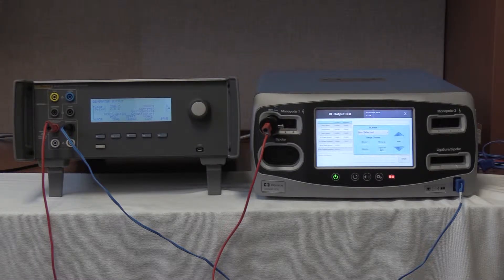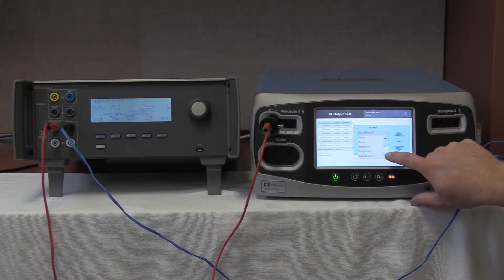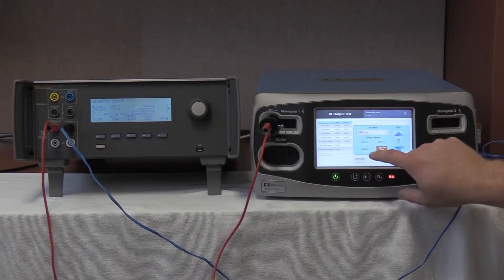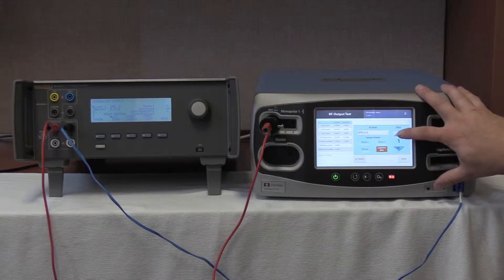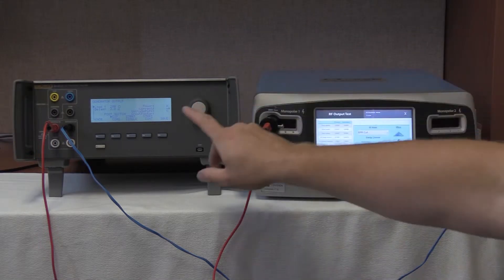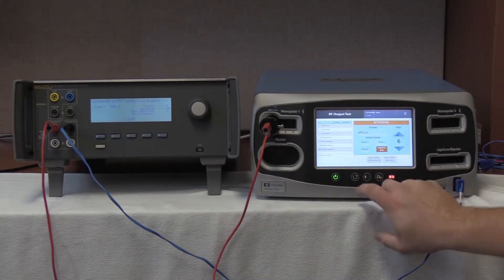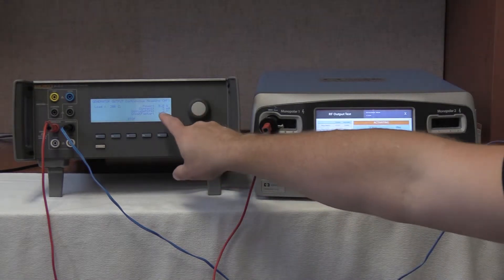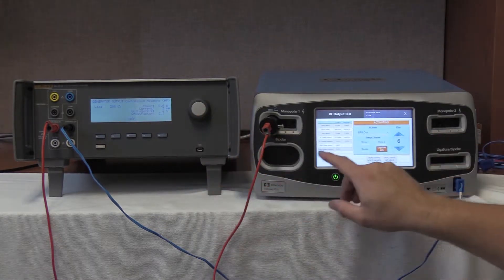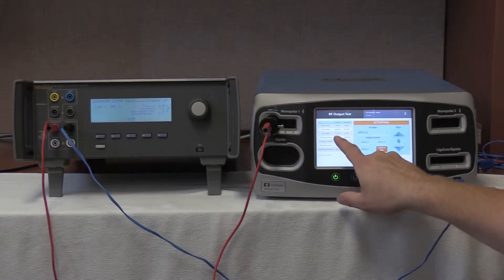On the FT10, we are going to select the bipolar resection cut. Push to RF mode. Put the down arrow to BPR cut. Max, and we are going to go to Effect 6 for max setting. Start continuous on the QES-3 and activate on the FT10. We currently have 3 milliamps of output, and here we are reading 186 milliamps of output.